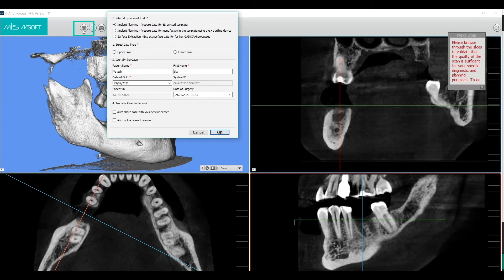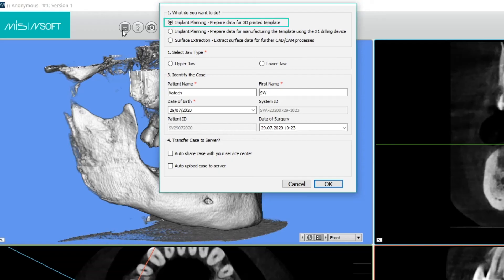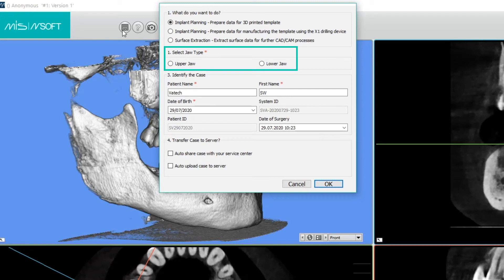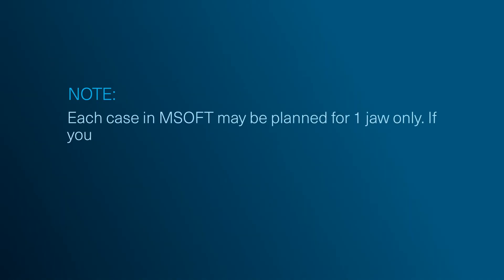Once saved, MSoft will show this data window. The first option is the default choice. The second option is not relevant since we do not intend to export to CBCT for manufacturing purposes. The third option will only be chosen in cases where you want to save the CBCT in STL format. In this section, you will choose the jaw that will be planned in this case. Note: each case in MSoft may be planned for one jaw only.